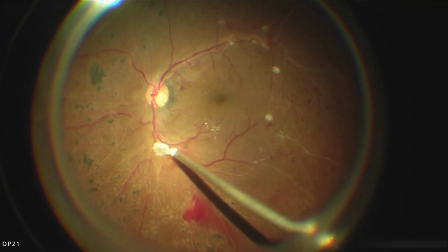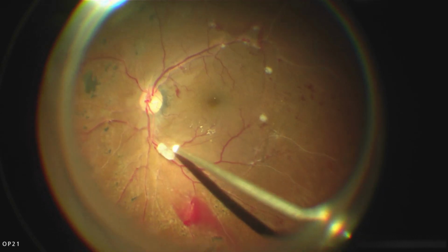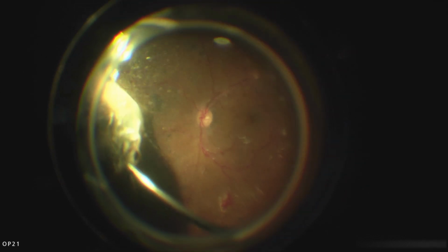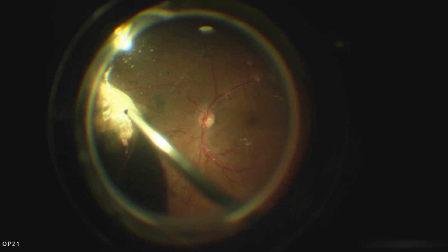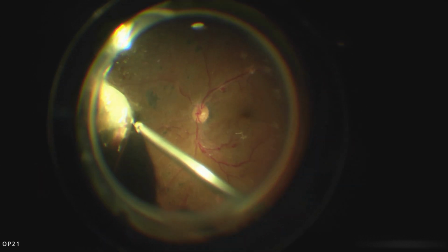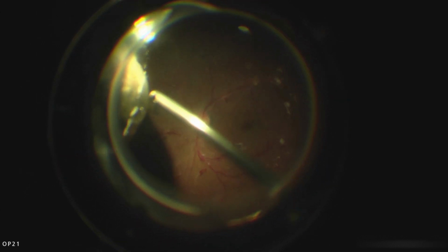And so this is the fold back technique, with delamination and segmentation using the cutter alone. This is a one-hand technique. I do always use a chandelier, just in case I need my other hand. And you saw that I did diathermize some bleeding vessels. I generally try to be as restrictive as possible with the diathermy, as it could cause holes in the retina as well as impair the circulation somewhat.